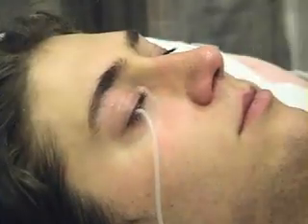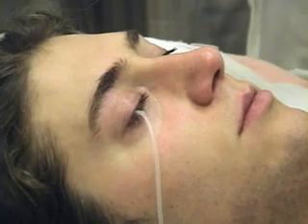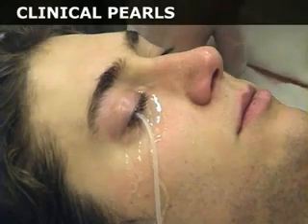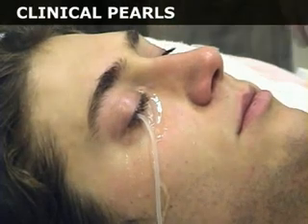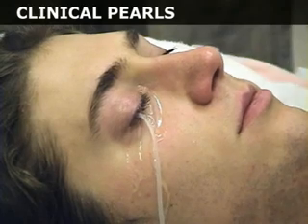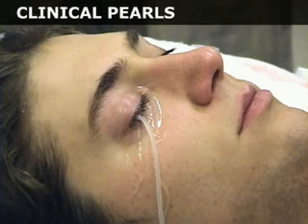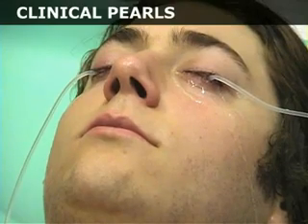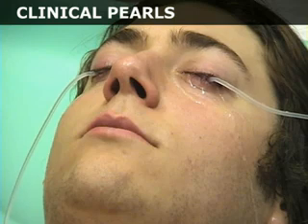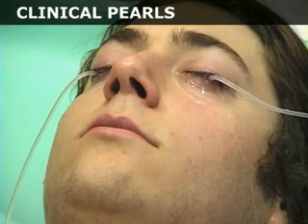Once the lens is fully inserted, increase the flow of saline through the tubing. Morgan lenses do not provide vigorous irrigation and may not thoroughly irrigate the fornices. They should thus be used only after primary irrigation with one liter of saline. Morgan lenses are useful in cases in which bilateral irrigation is required, as they allow a single clinician to irrigate both eyes simultaneously.